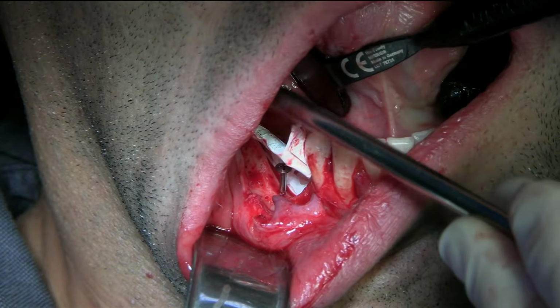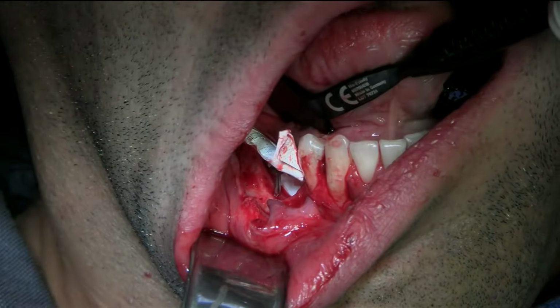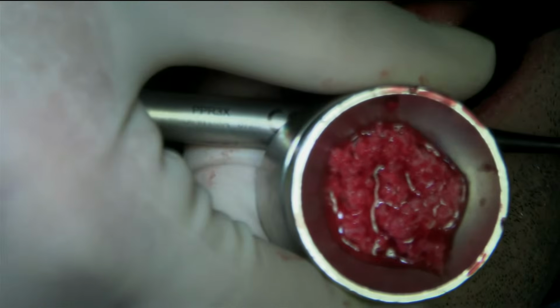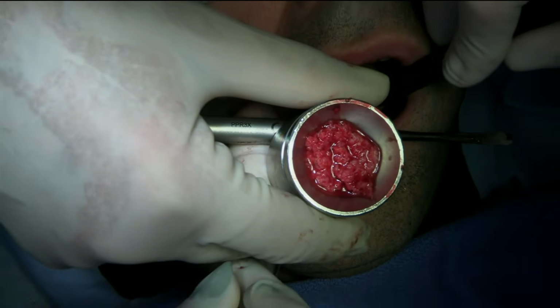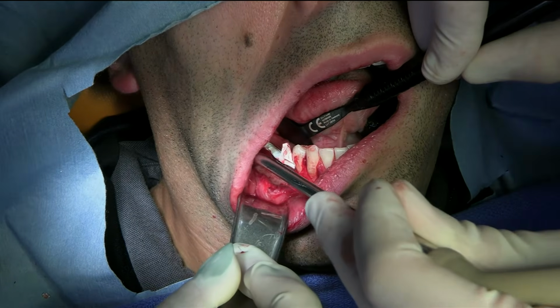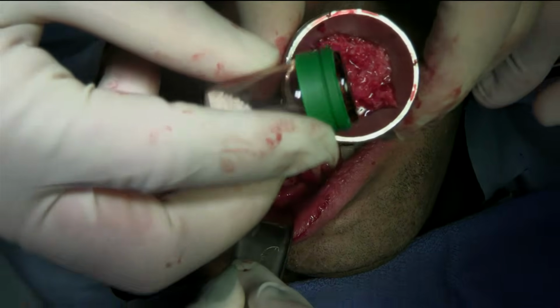And we have, obviously, a lot of autogenous bone. So that's quite a bit. I'm starting off with 0.5 gram of bios, but that's probably two thirds.